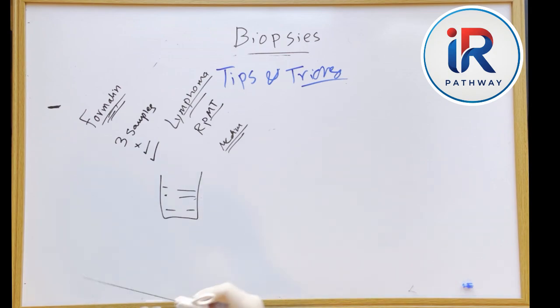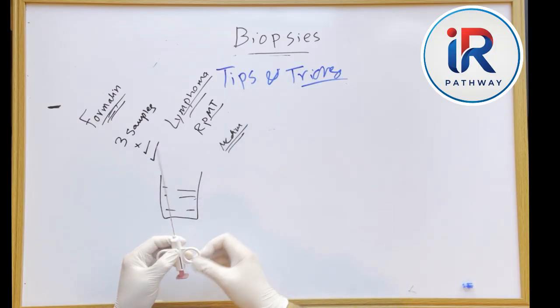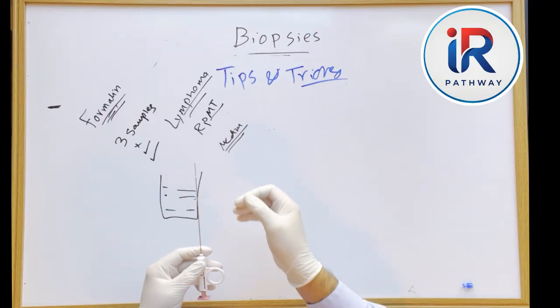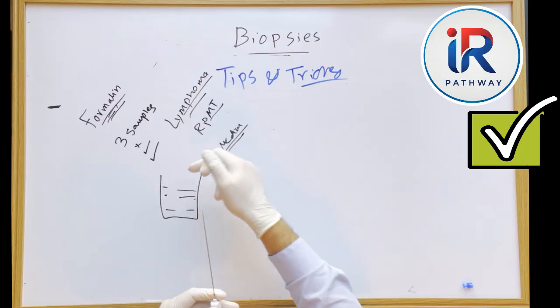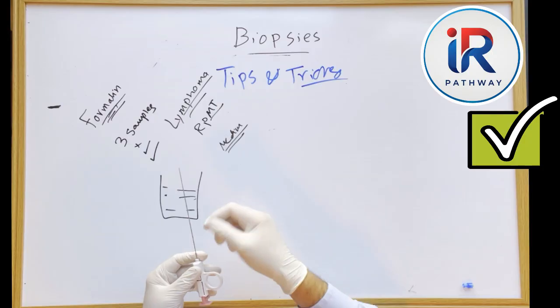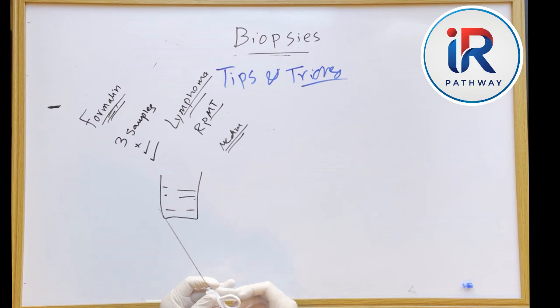Also, there is no such thing as wiping it off and using it again. This is not recommended. What you should do instead is either use the tip of the needle or a scalpel to gently transfer the specimen onto the blade, then place it into formalin. In some biopsy sets, there is a plastic device designed to help you transfer the sample safely. So again, please don't place the needle in formalin and then reuse it on the patient.